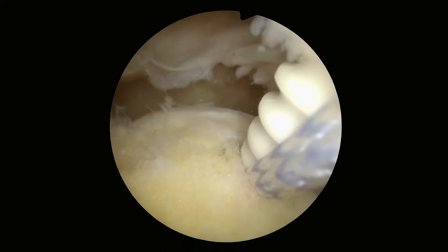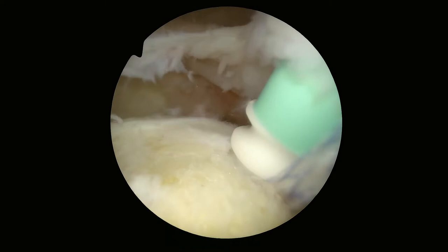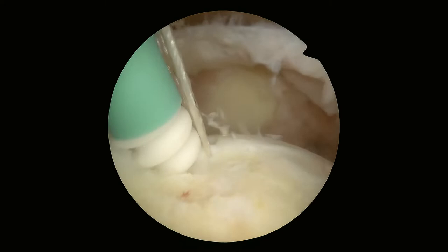So this is the anchor going in. My camera is lateral and I'm basically looking towards the midline — we're sitting on the shoulder, looking medially towards the neck. That's one of the suture anchors going in, and this is the other suture anchor going in.